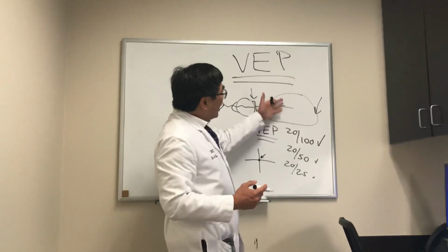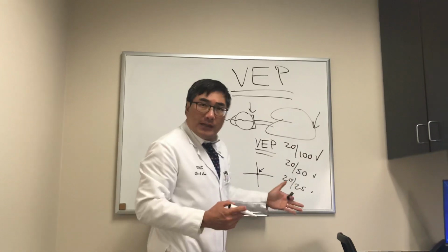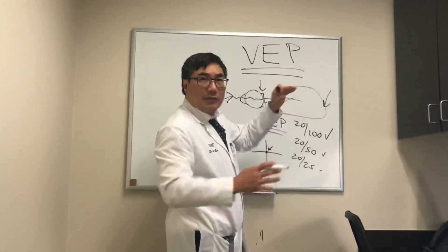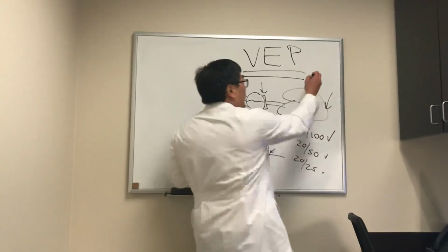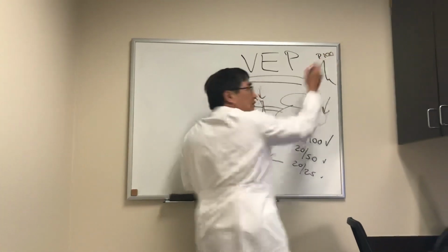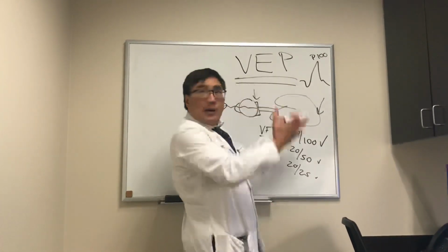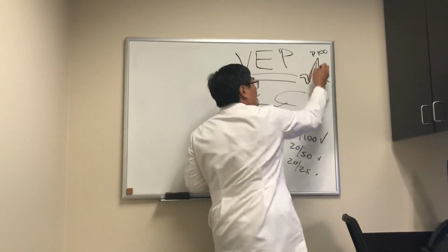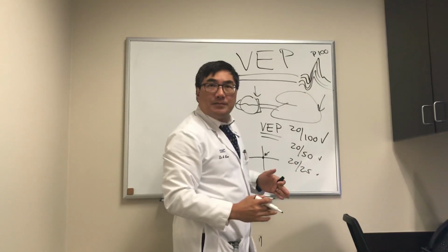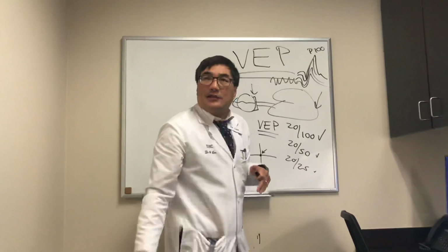So extracting the evoked potential, multiple trials have to be done. When we do enough trials, we can make the background electrical activity go to zero because it'll eventually cancel out. So we'll have a negative deflection and then a positive deflection. That positive deflection occurs at 100 milliseconds. And so the sum of multiple trials is what we're seeing when we see the visual evoked potential. And over time, all the background noise just cancels itself out.